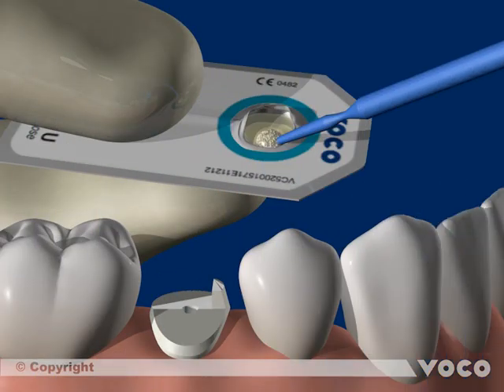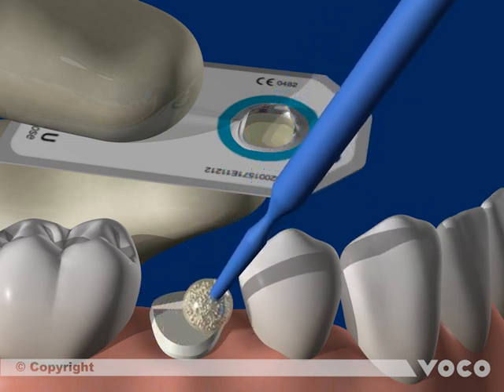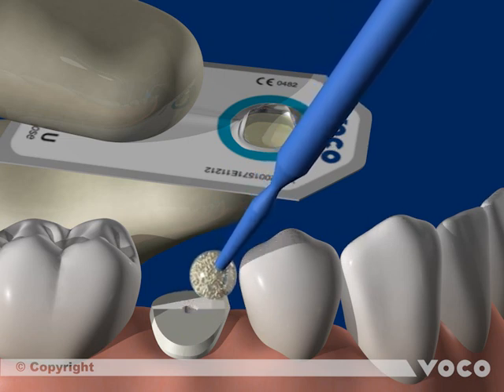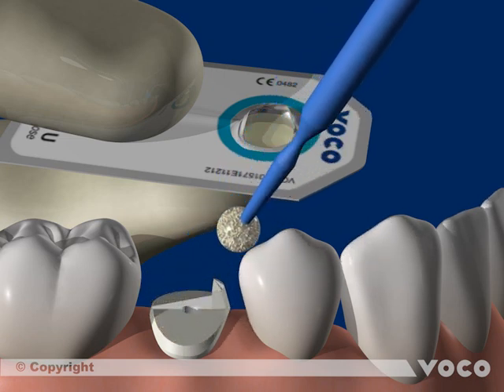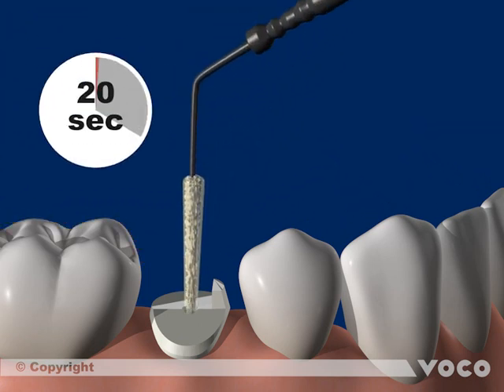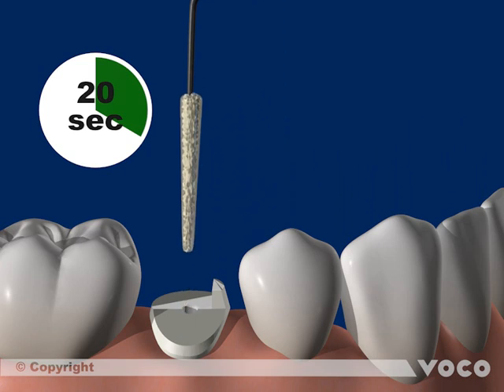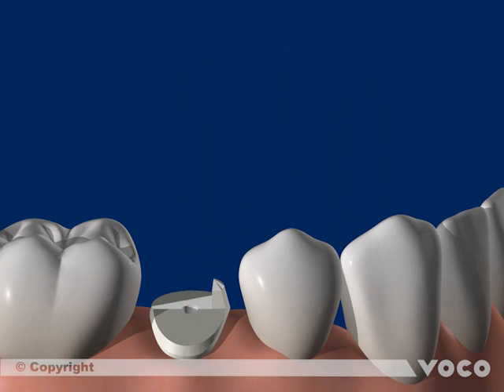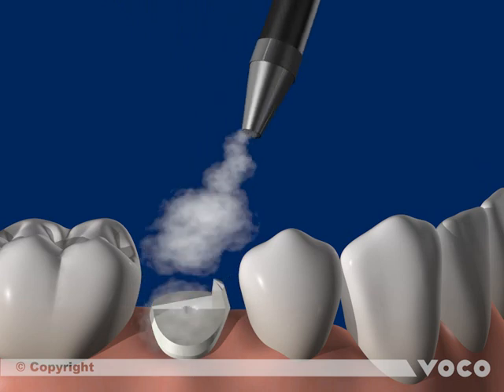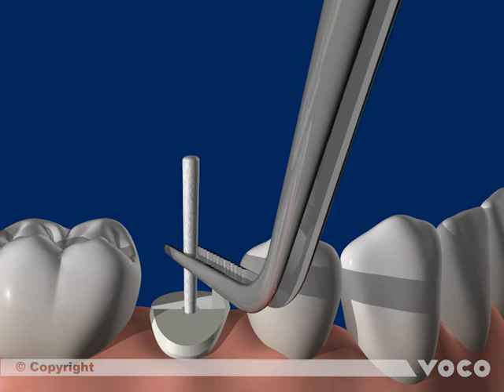In the meantime, the single dose blister is activated and opened, and the adhesive is applied coronally and rubbed in for 20 seconds. For application in the root canal, a special applicator, Endotip, is used to also rub in the adhesive for 20 seconds. Remaining adhesive in the root canal is then removed with a paper point.